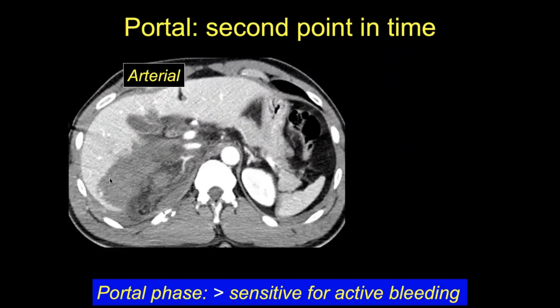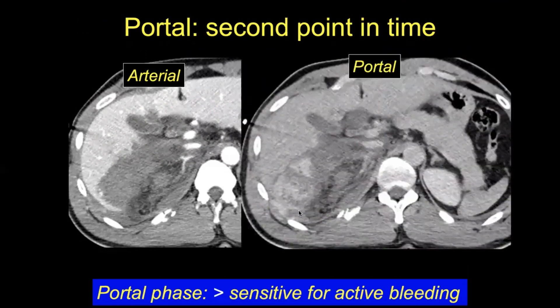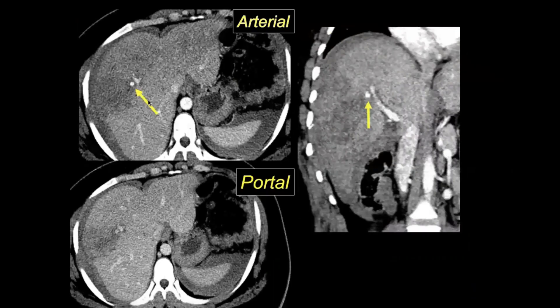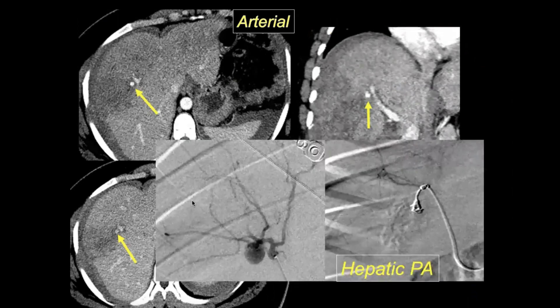In this example, there is an extensive liver laceration and the portal phase demonstrates significant active bleed. Note how there were only a couple of small foci of active extravasation on the early arterial phase; the portal phase provides a second point in time to assess the rate of bleeding. In this case, the arterial and portal phase demonstrate a small pseudoaneurysm that does not change in size and morphology between the two phases. The patient was treated with embolization.